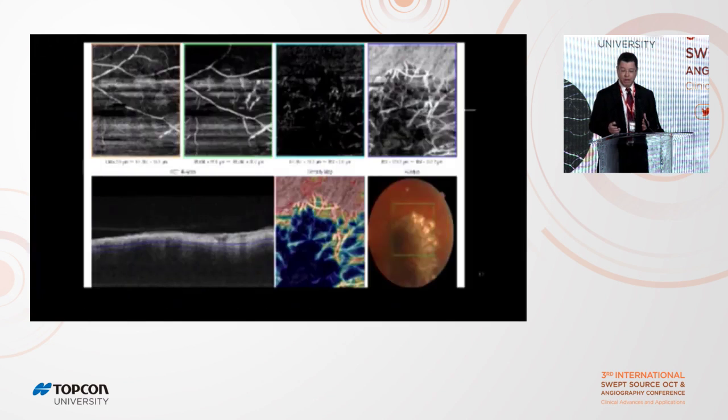And the OCTA demonstrates that there is a vascularity that we could study depending on the pattern, and we're looking at a lot more cases to try to correlate these patterns with growth and also with the possibility of metastasis.